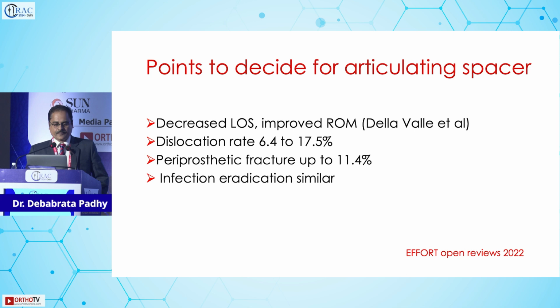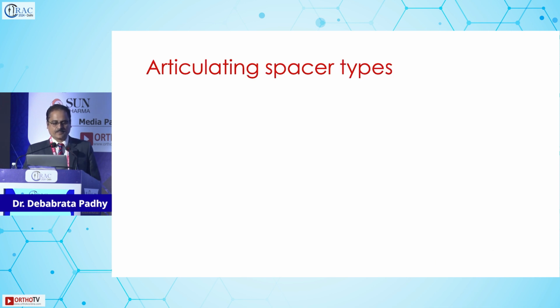So to decide on the articulating spacer, we should know that with the articulating spacer there is decreased length of stay in the hospital and improved range of movement. The dislocation rate is lower than with a non-articulating spacer. There may be periprosthetic fracture, but it is almost lower than with a non-articulating one. Infection eradication is almost similar to that of a non-articulating spacer.